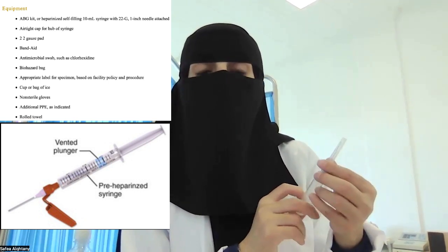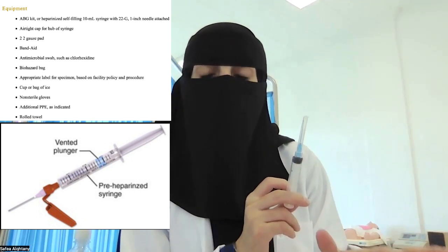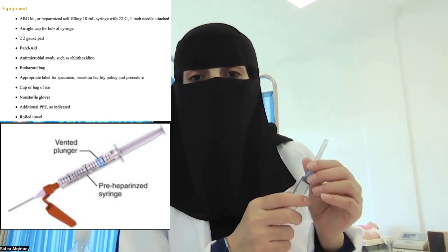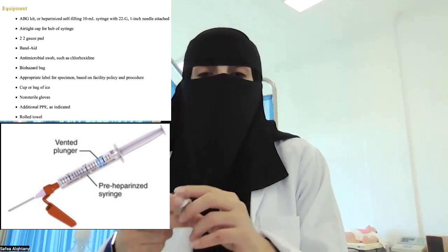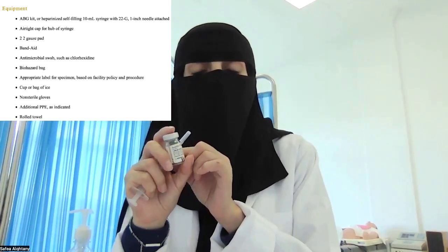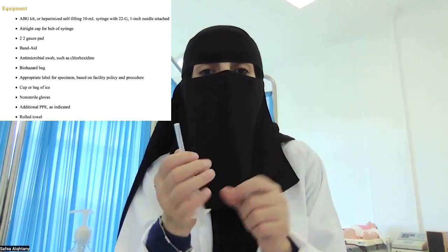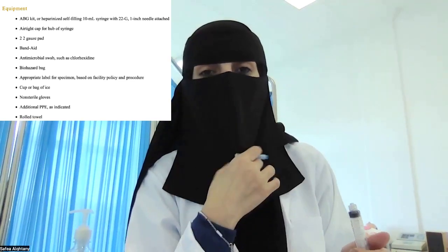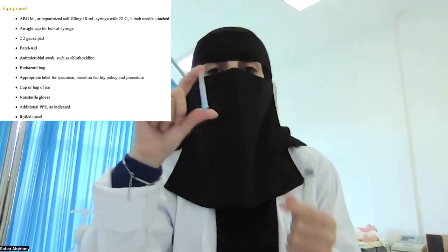However, if we don't have the heparinized self-filling syringe, we can use a syringe, and then we need to obtain heparin and insert it inside the syringe. How much do we obtain? We obtain 0.1 ml for a 5 ml syringe. For ABG sample, we need to take 20 to 22 needle gauge، يعني يكون السايز تبع النيدل من 20 إلى 22.